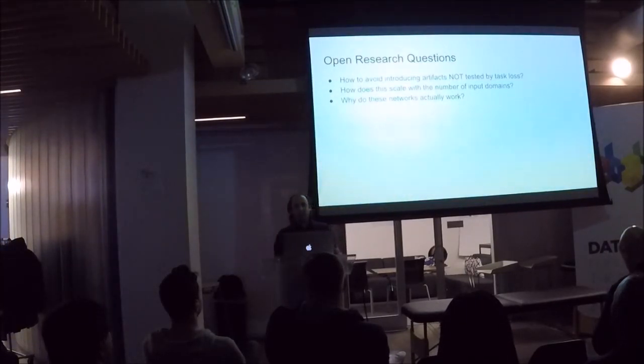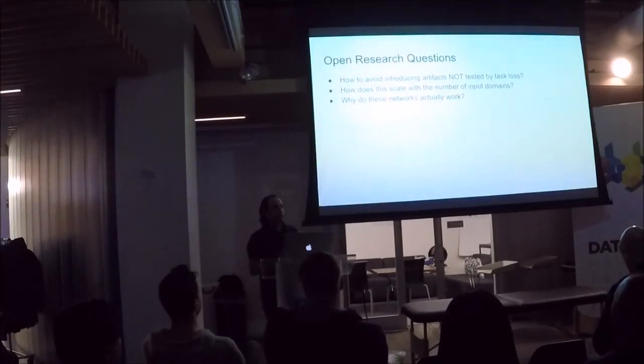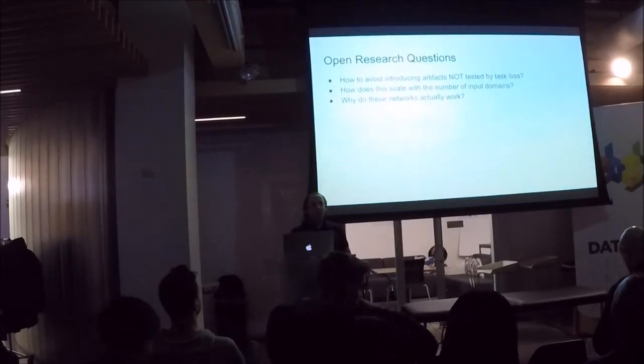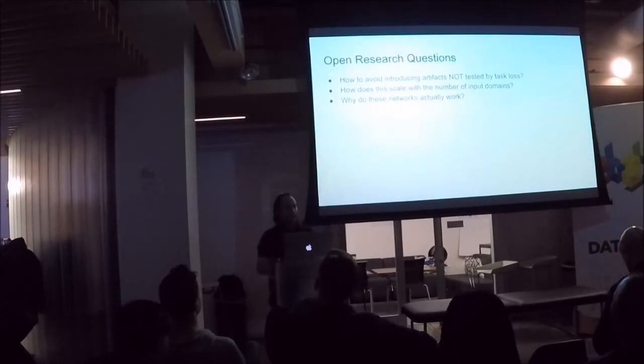So we can imagine having a separate encoder and decoder for Philips images and a different one for GE images, and so on and so forth. As the number of domains increases, do we just scale linearly? Again, that seems somewhat unideal.